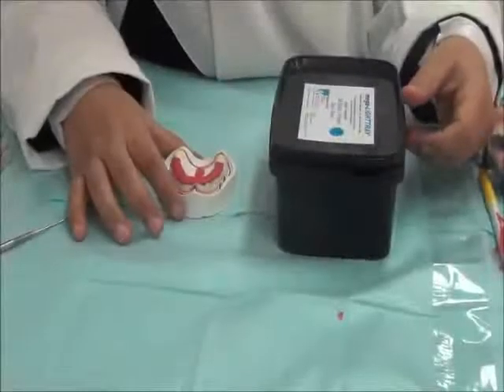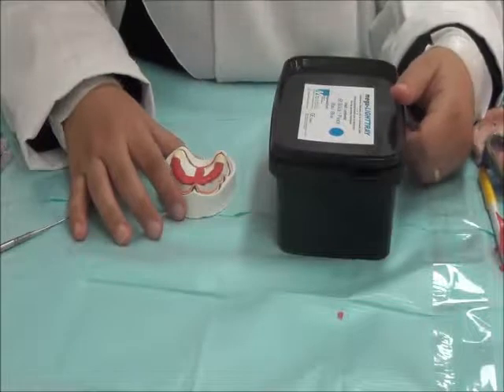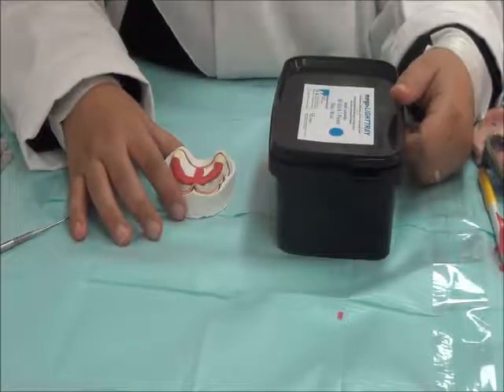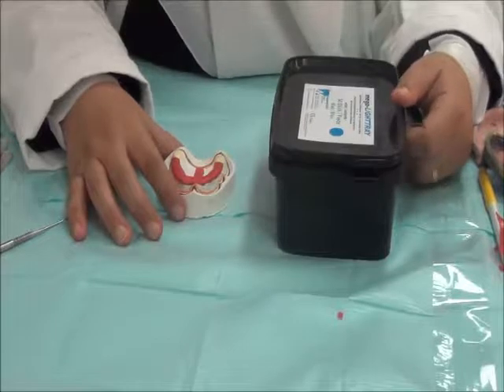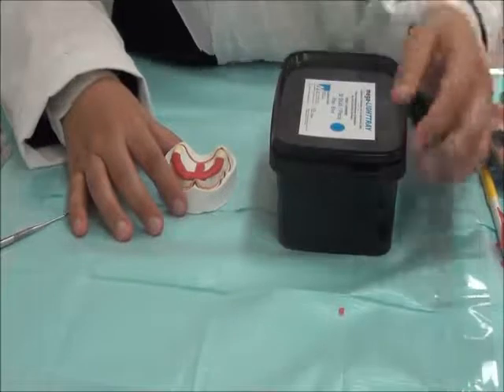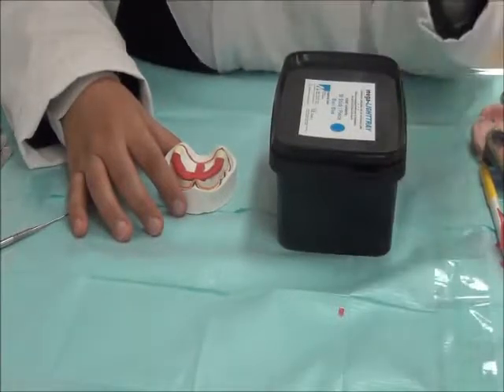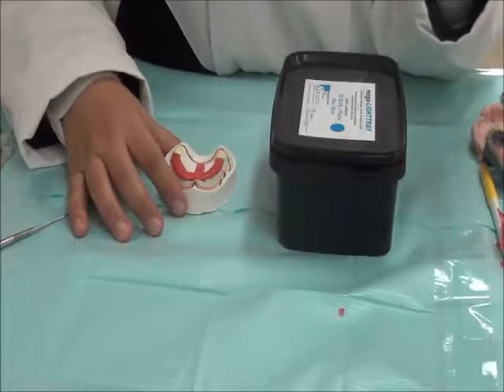Now we're going to do the step where we're going to construct a tray over this spacer. For trays, we need them to be hard and rigid. So we use a material that is easily shaped, and once it's set it becomes hard, and the suitable material is acrylic. Acrylic can come in light cure or in cold cure method, powder and liquid mixture.